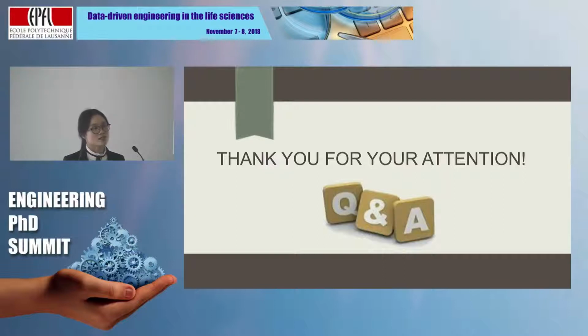We set constraints on the shear forces. It cannot exceed a certain limit. So you have a threshold. Okay. And that might depend. Sometimes shear stress can be good. Sometimes you even want to manipulate a bit and move things around. So I guess you will tune it depending on what type of surgery and what type of tissues you manipulate. Actually, we just applied it to artificial tissue made of silicone.